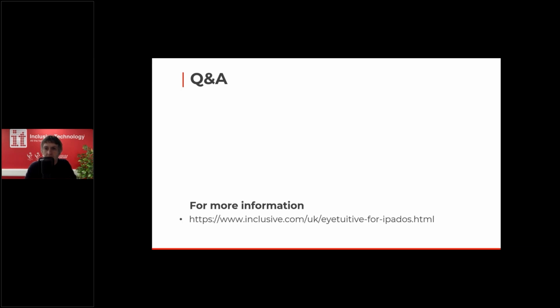So let's see. Do you need a mounting bracket for the eye tracker if it was going to be attached to a grid pad? If you're going to be attached to a grid pad, I'm not entirely sure how it would attach to a grid pad. I know grid pads are made for specific eye trackers, so we'd need to look into that and see how it would attach.